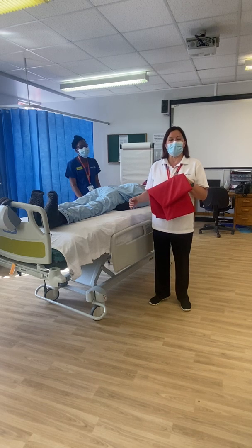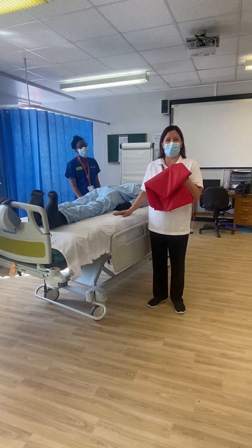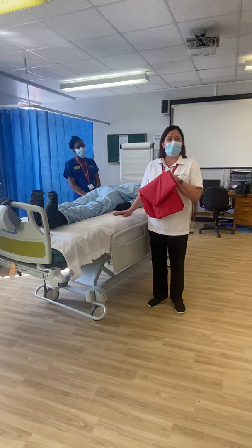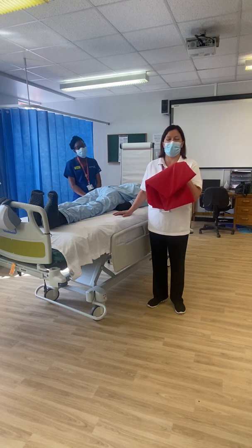So the idea is that if somebody comes into ED with mobility restrictions, they would get a slide sheet as soon as they got here to effect any transfers that they needed. That same slide sheet would then go up onto the ward if they were admitted and would be used for the transfers up there, because you can use them multiple times. Please also remember that if your patient on your ward needs to go somewhere like X-ray or MRI, to send this slide sheet with them, because they will still have mobility restrictions when they go to another department in the hospital.